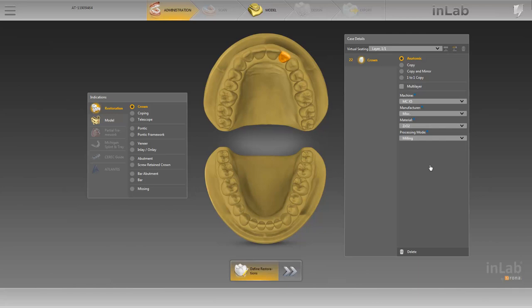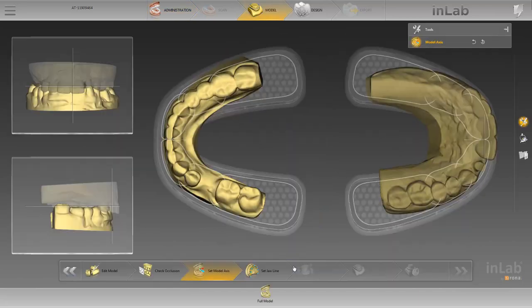We move to the model phase by clicking the double arrow. Since the model data are transmitted with the Atlantis core file, we can skip the scan phase and continue with the model phase.